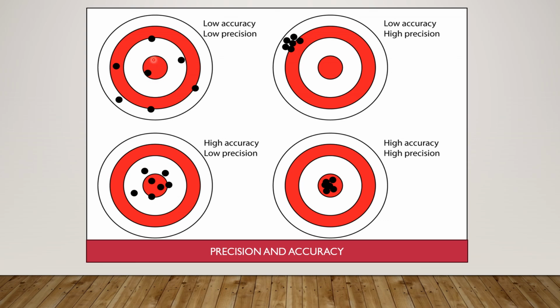And whatever tests we are applying in the laboratory, the results come somewhere away from this true value. And this one is more away, and you can see the trend here. So this result, as compared to this one, this dot is quite away. This is quite beyond the true value. So this is less accurate as compared to this one, which is very close to the actual value. So accuracy refers to the closeness of the result to the true value.